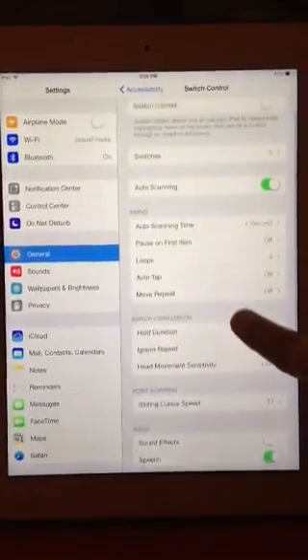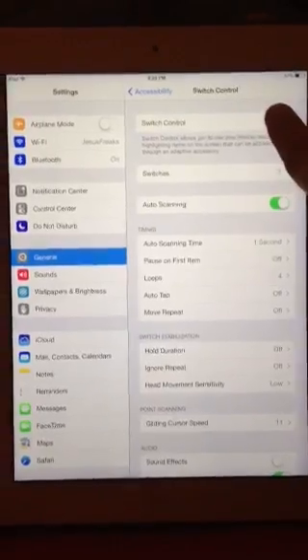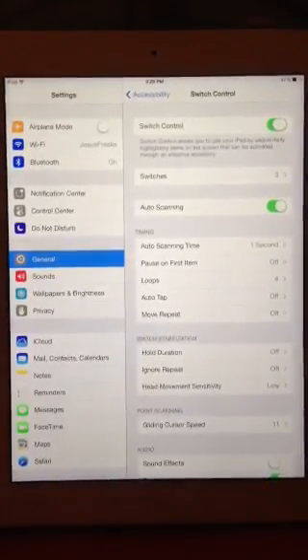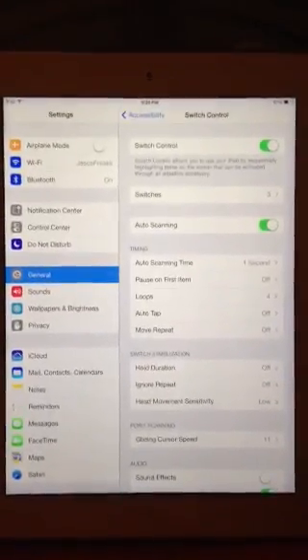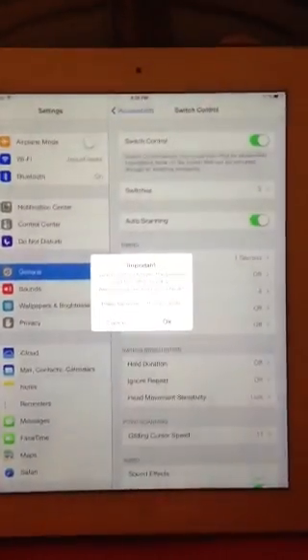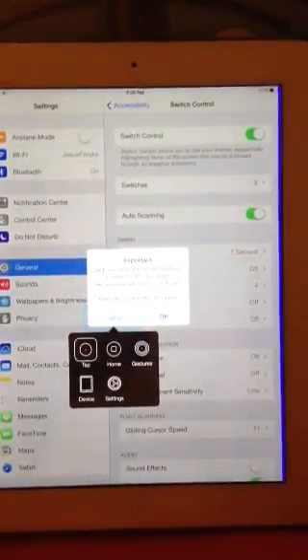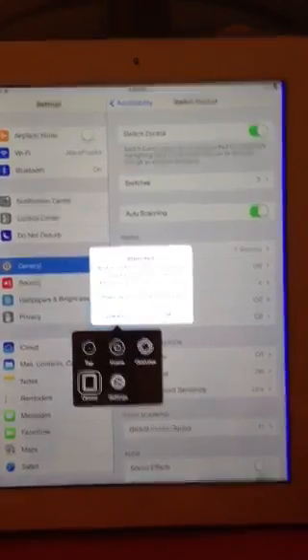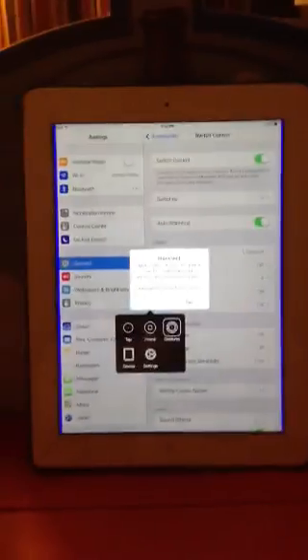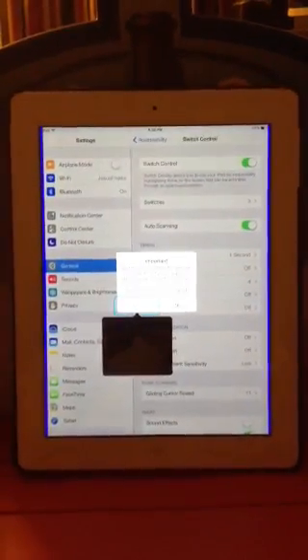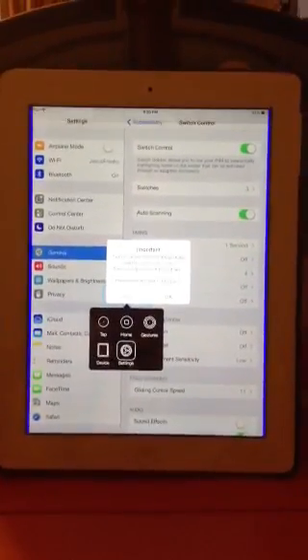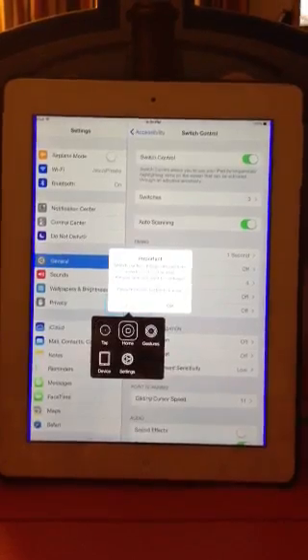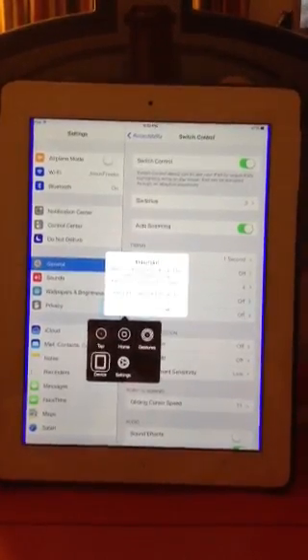I'm going to turn Switch Control on. Switch Control can also be turned on by triple-clicking your home button. Right now it's going through — you can see the blue lines on the edge of my iPad; that's where it is picking up my head movement. It's going really fast, so I'm going to stop it.